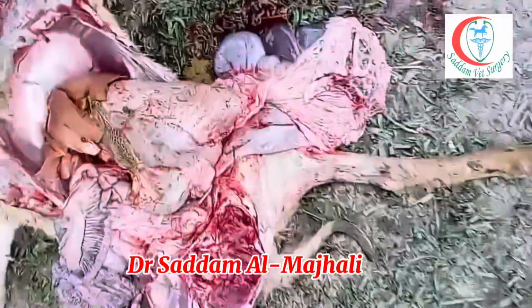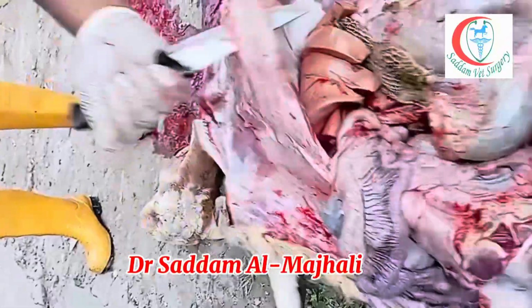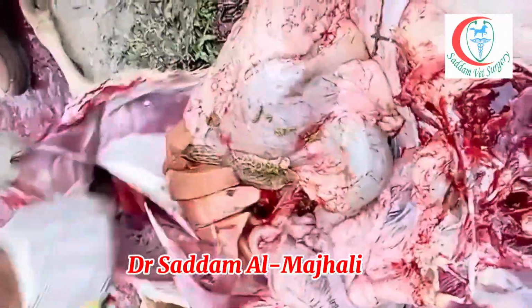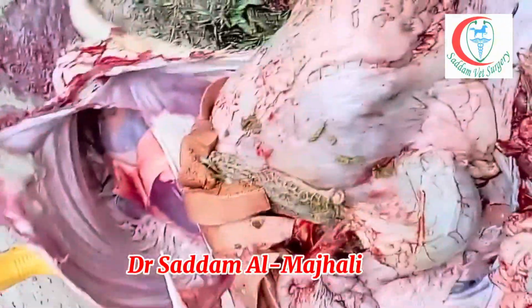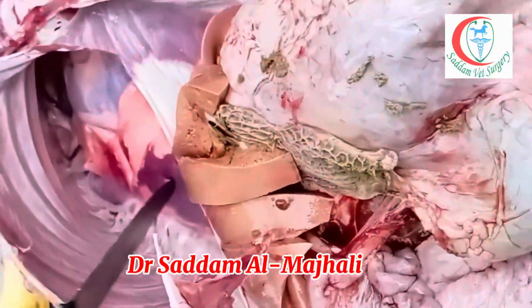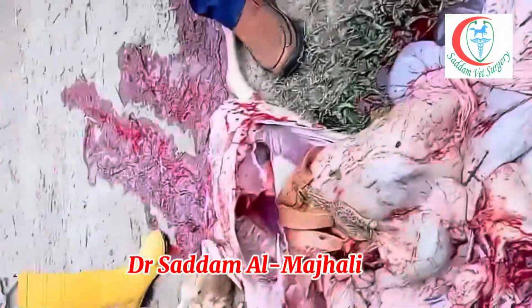Okay, we go to the other side, the thoracic. How to open the thoracic? This is the diaphragm. I want to see the lung. Can cut this one first, to the end, I broke it. Then I open this, the diaphragm. I can see. You see inside? What do you have? The lung. This is the lung. Why is this one black? Congestion here, bleeding, hematoma. Why? Because of a long time sleeping, the blood has come down here.